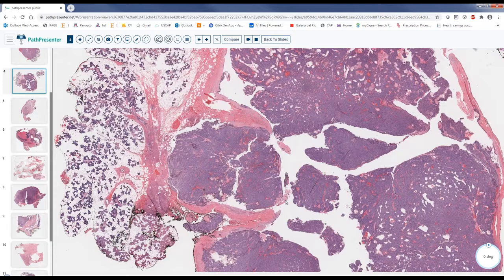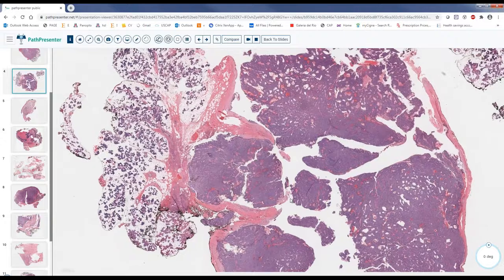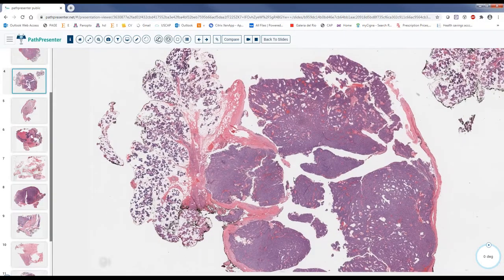If it is worrisome, just describe that. You just say basaloid neoplasm. You say that you are favoring adenoma, but because of some areas that look like capsular invasion. Of course, you give them the margins are clear. Basically, if the margins are clear and you are comfortable with that, there are no other worrisome features, probably the surgeon will be happy with that, and they will put the patient for observation.